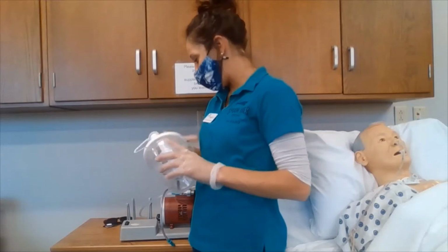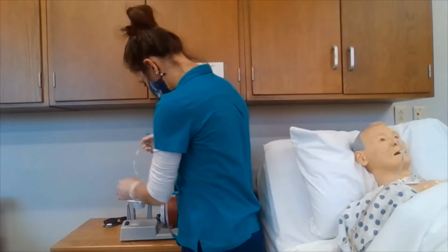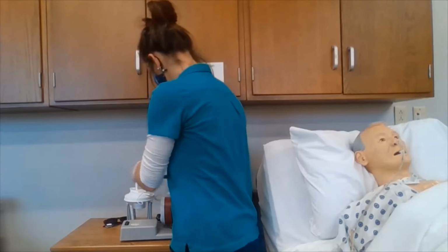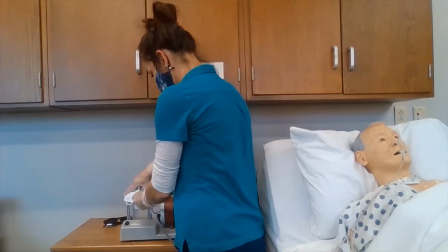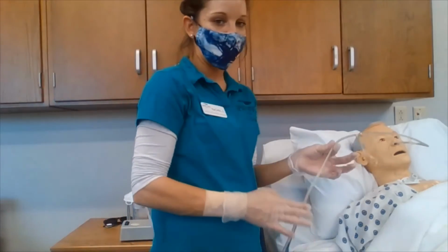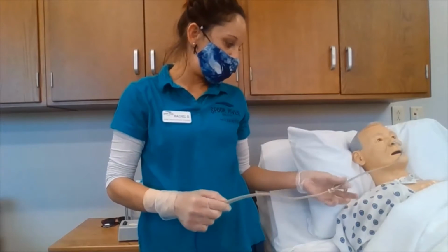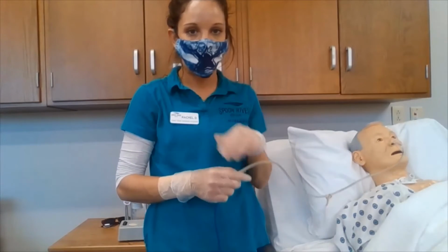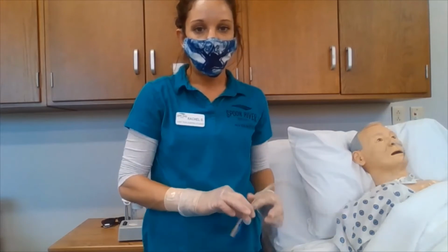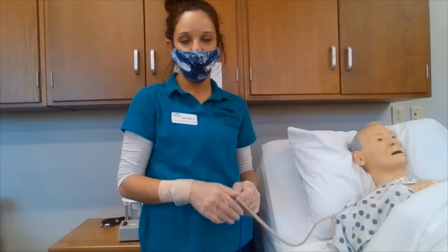When we are done, we are going to make sure that we put it back and our connections are the way we had it before. We are going to be then turning our suctioning on, making sure that we are unclamping the nasogastric tube. Also going to be assessing for patency of the tubing. We are going to make sure that it is suctioning properly, make sure that everything is disposed of properly, take our gloves off and wash our hands.